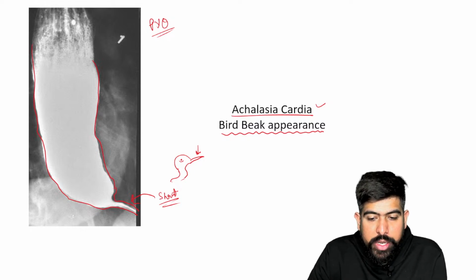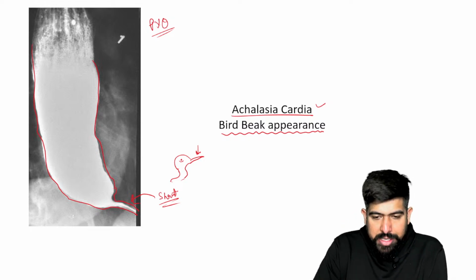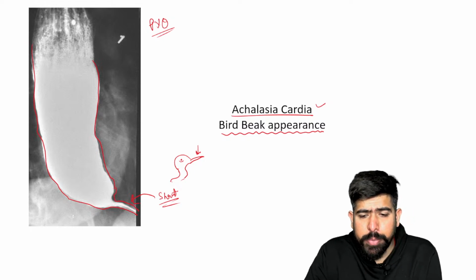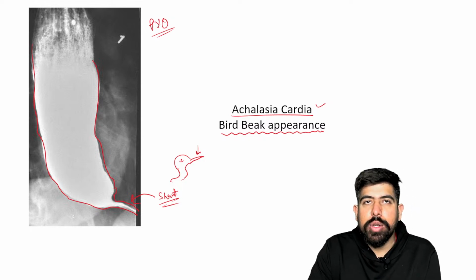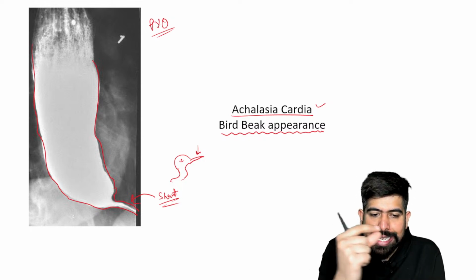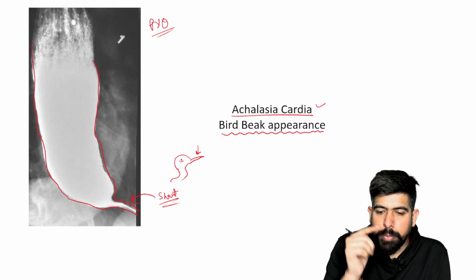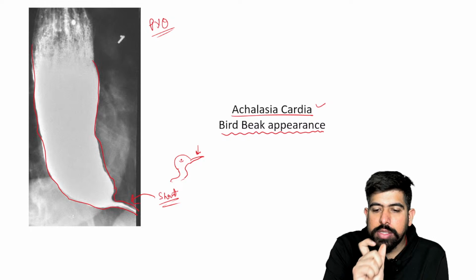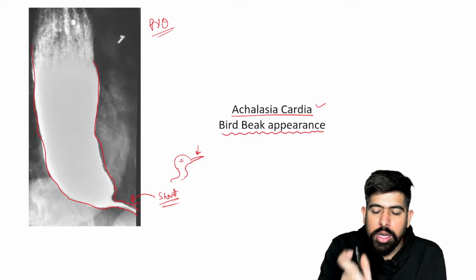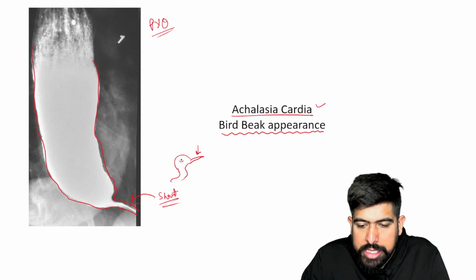Yes, rat tail is different, doctor. Please remember, rat tail I am going to show you now. Rat tail is totally different. Just think about the bird beak. Rat tail will be in your cancer esophagus. I'll show you in the next image. Just remember, if the beak is there, I already drew one small bird, so you can say the bird's beak is very short. The narrowing is very short, and it is always at the lower part of the esophagus. Difficulty is more for liquids than solids.